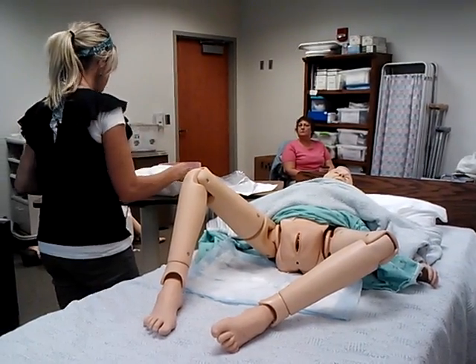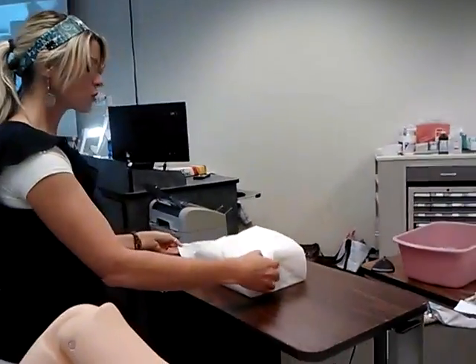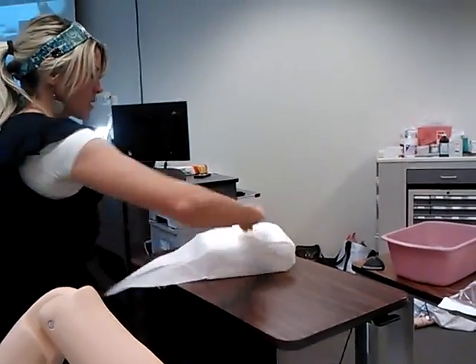That's going to be my garbage. Okay, and you're going to have to do this sterilely. So you open the side. You're actually supposed to.